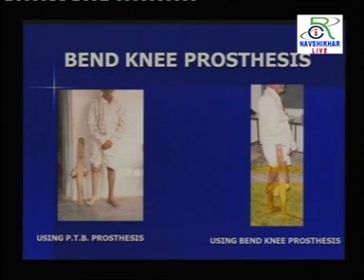उसके टांग के अंदर जो है contracture बनने की बात हो रही थी, जो पहले बताया था मैंने, लंबा मोड़ के रखने से क्या होता है, फिर contracture बन जाते हैं. बट इस केस में उसको contracture नहीं हो पाया था. वो active enough था, बहुत अच्छी मूवमेंट करता था, चाहे काफ़ी उम्र है उसकी, लेकिन फिर भी अच्छे से चलता था. तो नी उसका सीधा हो जाता था. तो वी मेड ए रेगुलर प्रोस्थेसिस फॉर हिम ऑल्सो. सो ही हैड बोथ द ऑप्शंस विद हिम.